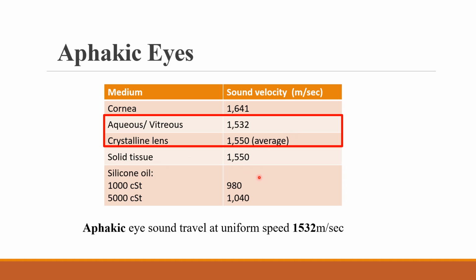Solid tissue, 1550 meters per second. In silicone oil, in case of 1000 CST, 980 meters per second. In case of 5000 CST, 1040 meters per second.